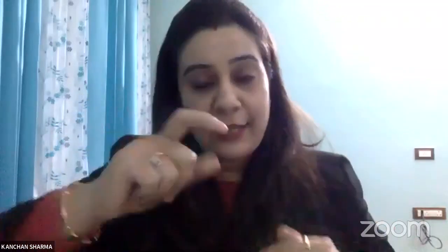And obviously it is the quadriceps tendon, then you have your suprapatellar fat pad, then your recess, the prefemoral fat pad, your articular cartilage, then the bone, right? So if you know that this hanging thing is the suprapatellar fat pad, then you toggle your probe. Tendons exhibit the maximum anisotropy, so the moment you tilt your probe, you will be able to understand that this is the tendon, this is the fat pad, and the very hypoechoic line which you will be seeing will be your recess, right?